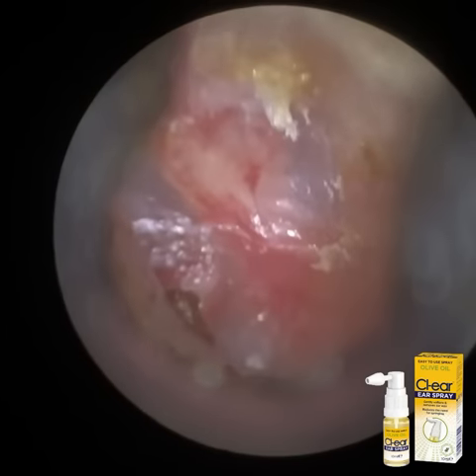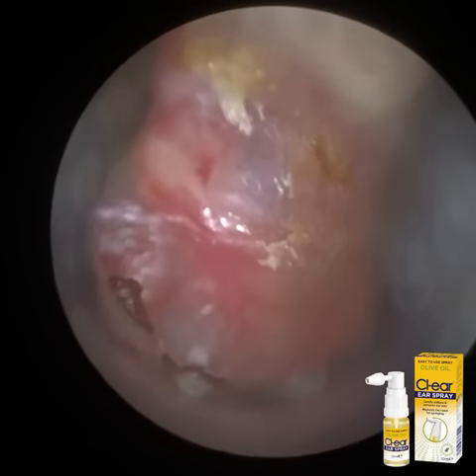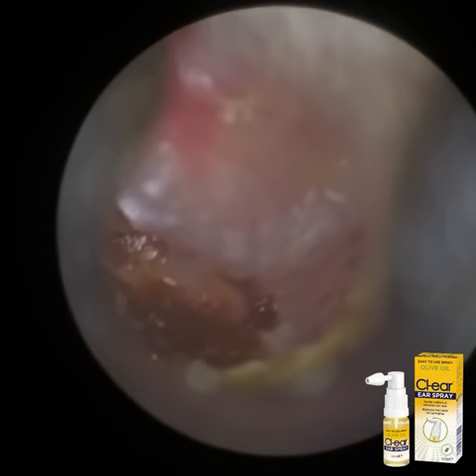So once more, I'm going to stretch the ear canal open. You can see the whole eardrum now. This wax plug was directly attached to the eardrum. You can see there's a bit of vascularity of the blood vessels around the umbo region, but otherwise everything's fine. Just some dead skin at the base of the ear canal. So again, I'm just going to adjust the focus.